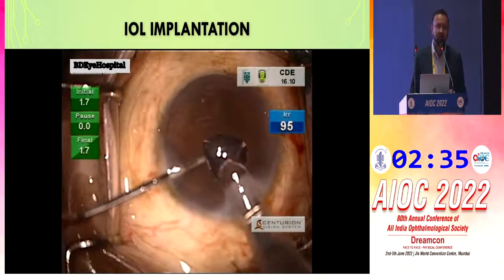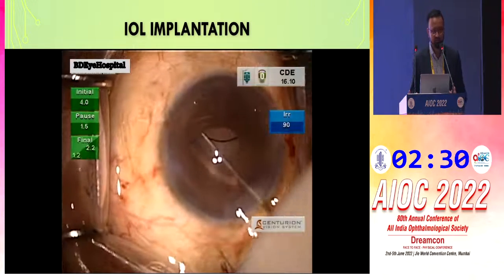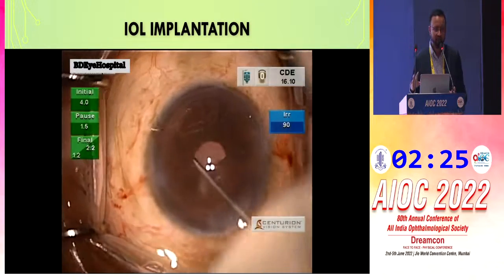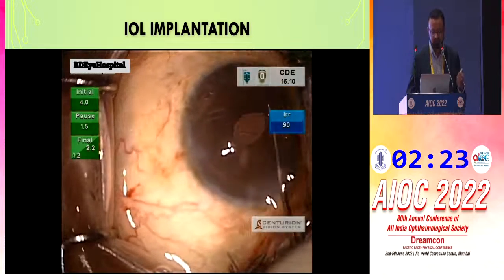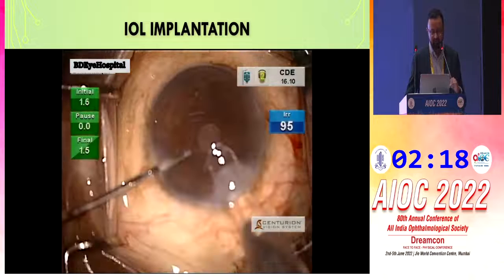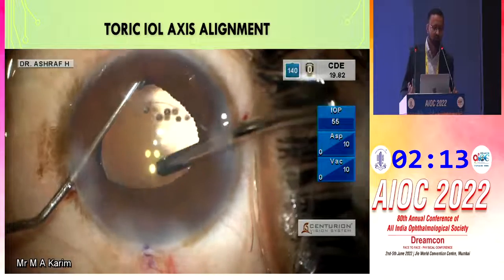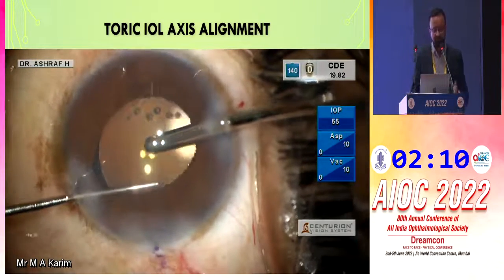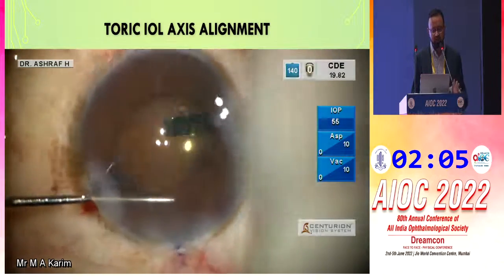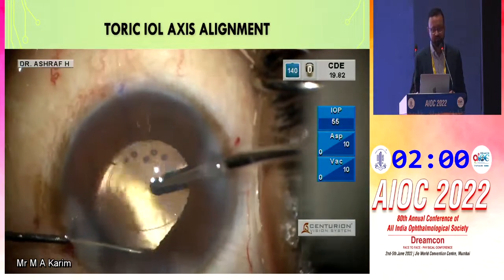For IOL implantation in small pupils, I always recommend in-sac implantation, not wound-assisted implantation. We verify the IOL is placed in the bag by gently pulling the iris with a ball dialer to confirm the capsule margin is visible. Toric IOL implantation is also possible with small pupils — we implant on the proper axis and confirm toric IOL alignment on the first postoperative day.